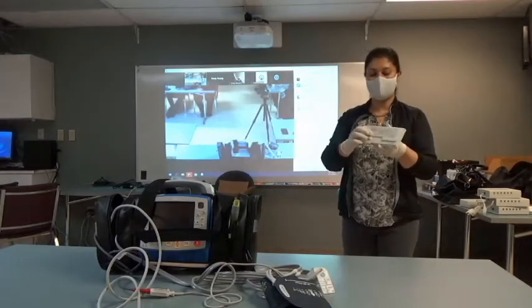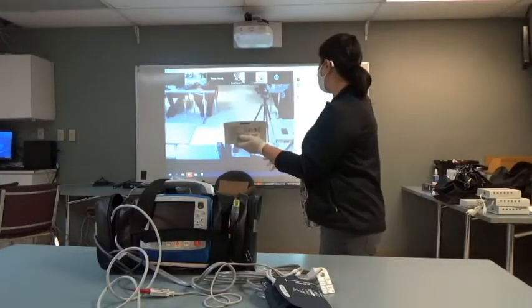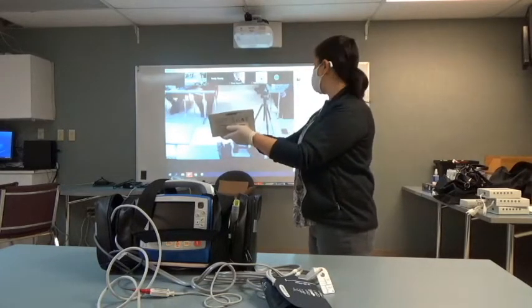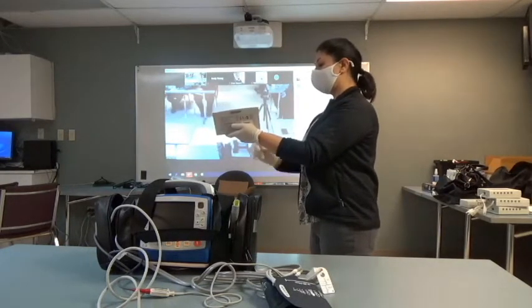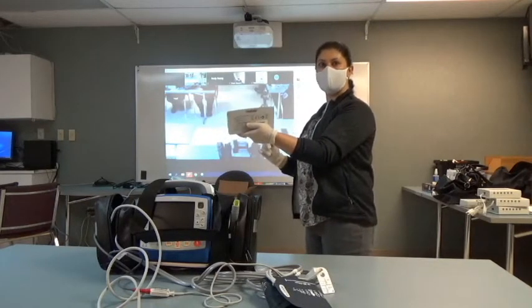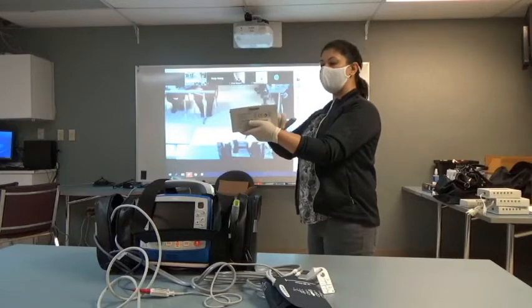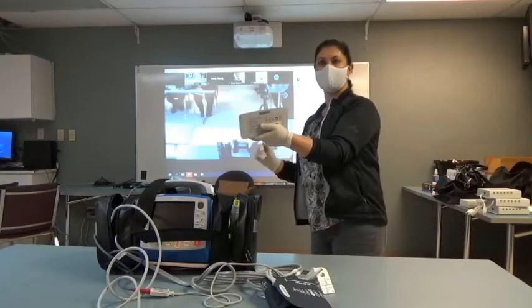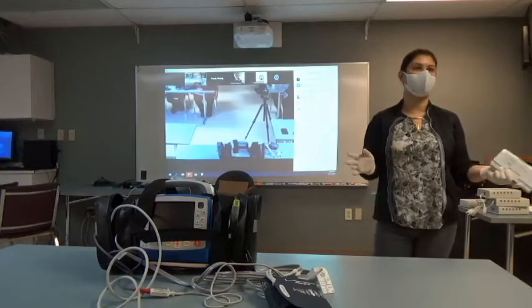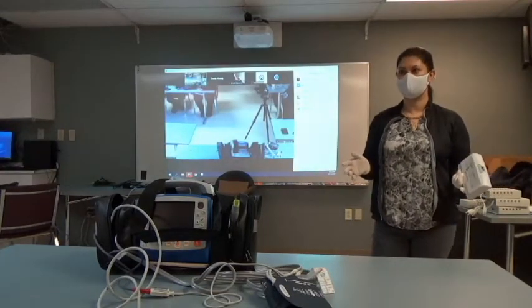So to check your battery, there's a circle on the front. If you press that and release, the more green that you have, the better. If you press and release and the red X stays lit, you want to take it out of service and let somebody know. If you press and release and the question mark stays lit, that means it hasn't visited a base charger in a really long time and it needs a recondition.